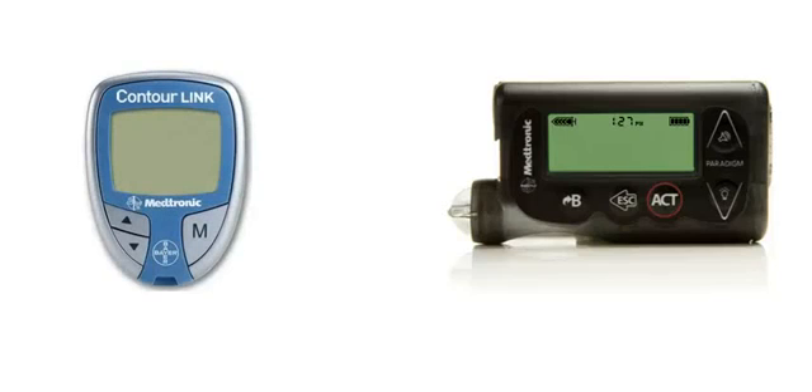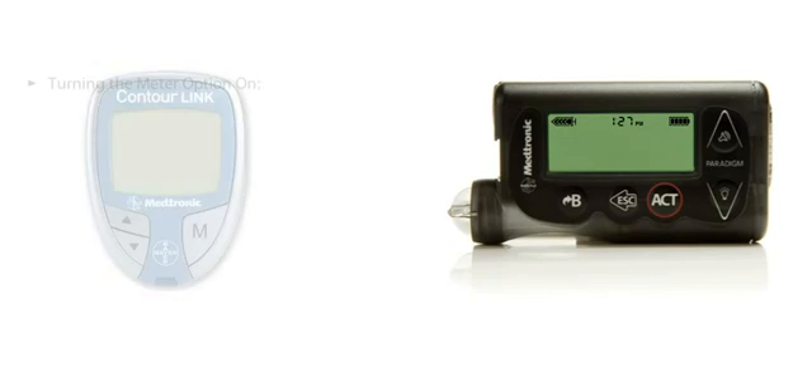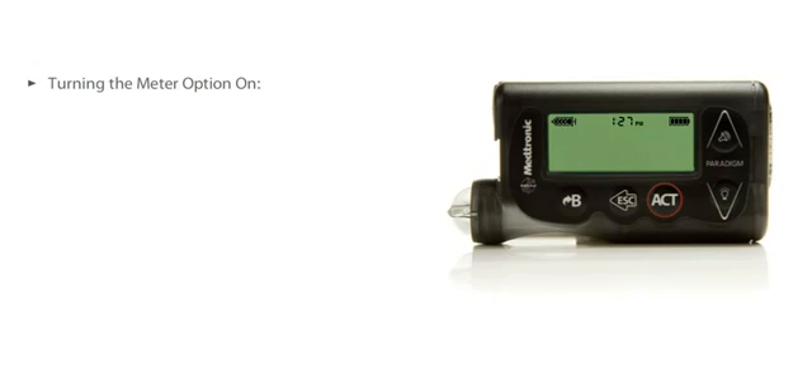First, follow the instructions that came with your new ContourLink meter to set it up. Next, you will need to turn the meter option on in your pump.